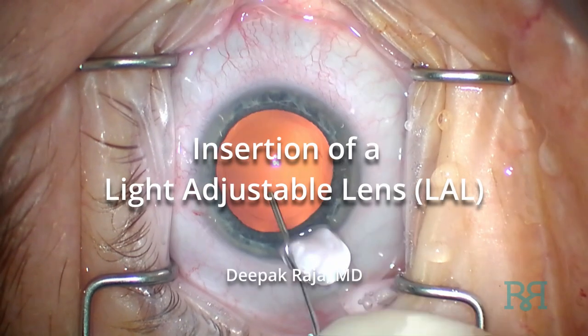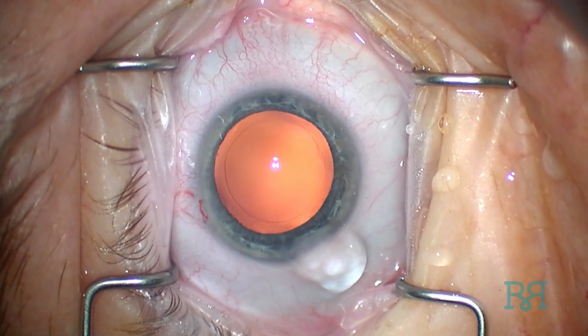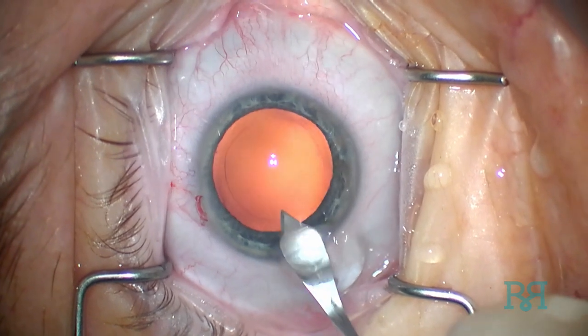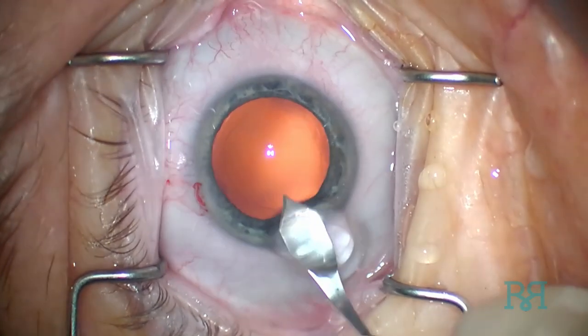The 3-piece light adjustable lens can be a little bit tricky to insert at first. After filling the capsular bag with viscoelastic, the temporal incision is widened with the keratome blade to approximately 3mm to facilitate entry.